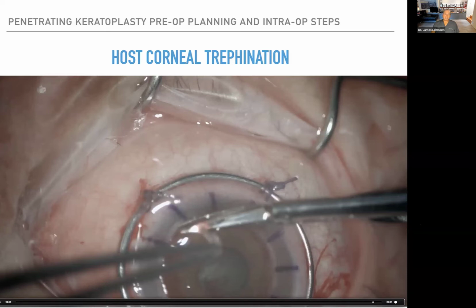Dr. Monira asks how to avoid damaging the iris in case of adherent leucoma. Well, in a case like that, I would make sure that you didn't enter the anterior chamber with the trephination. Also, prior to the trephination, you could make a peripheral paracentesis and fill the AC with viscoelastic to deepen it the most possible.